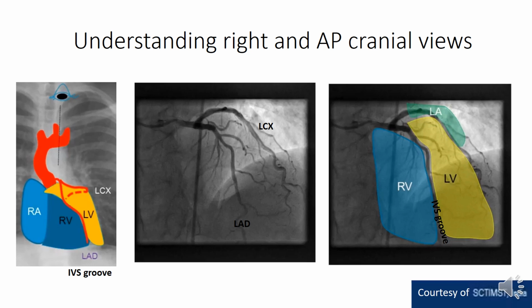And as we discussed before, when we are dealing with cranial view, the circumflex follows the view, so the upper one is circumflex.